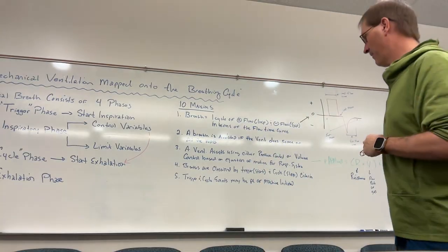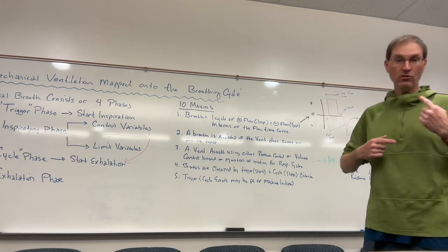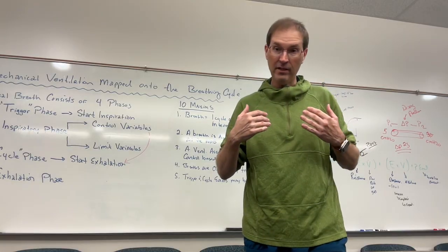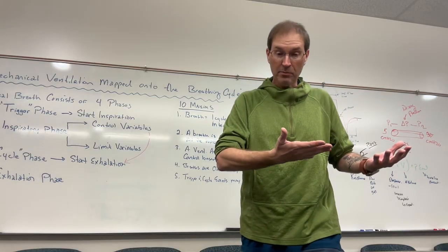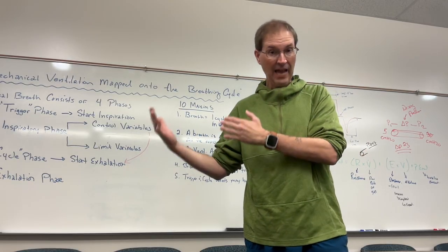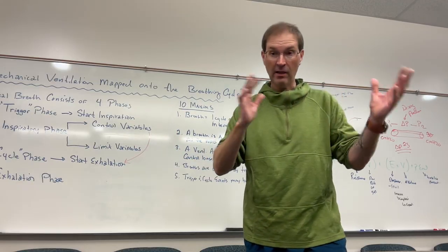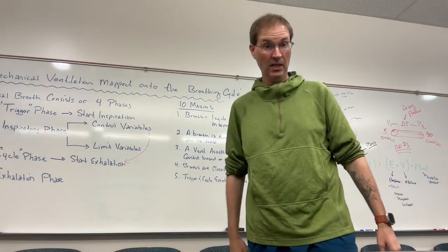And then breaths that are patient triggered and cycled tend to be what we call spontaneous breaths. And some mechanical ventilatory modalities allow for almost all spontaneous breathing. Some allow only mandatory, no spontaneous breaths, and then other modes allow for a mixture of mandatory and spontaneous breaths.